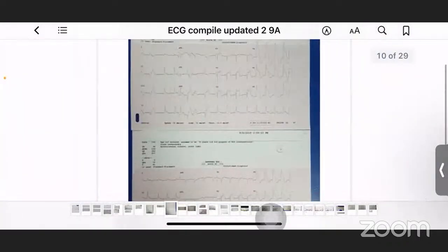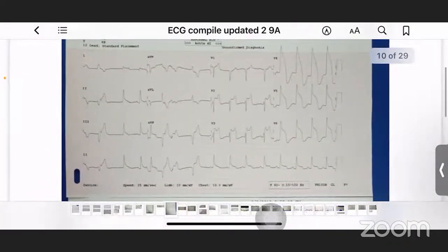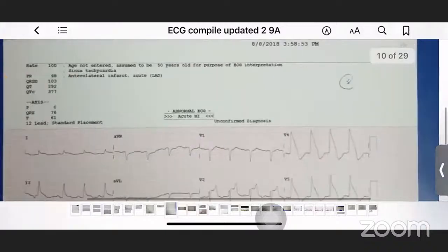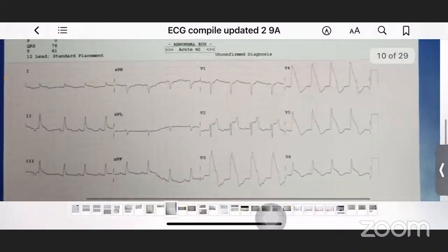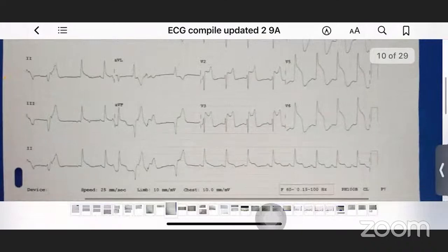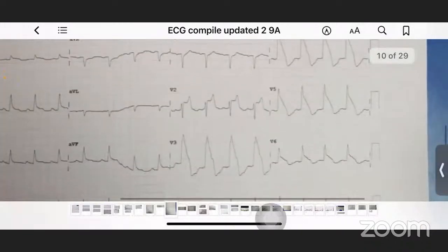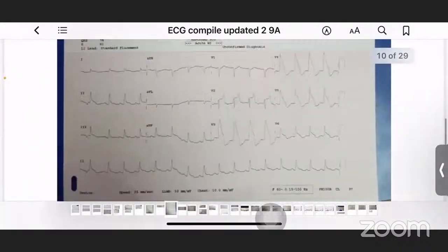So, subsequent ECG. In the first one you cannot see where the ST elevation is. But this ST elevation, doesn't it look like a saddle also? Concave, right? When you repeat now, it's already different. V3 is still concave, but when you repeat, V3 becomes broad already. So maybe it started with the lateral, then after that the septal also became involved.